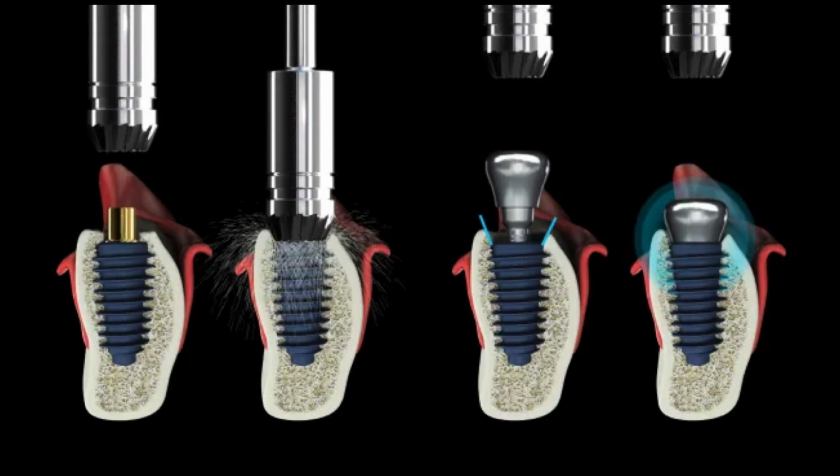And there is such an easy technique, and it's called the bone profiler system. This is a schematic of how this can be used. On the far left, you can see that gold structure, which is kind of like a small abutment with smooth surfaces, absolutely parallel, cylindrical, and the corresponding drill that has the right profiling angle is then used to line up with that cylindrical portion so that it doesn't move around.